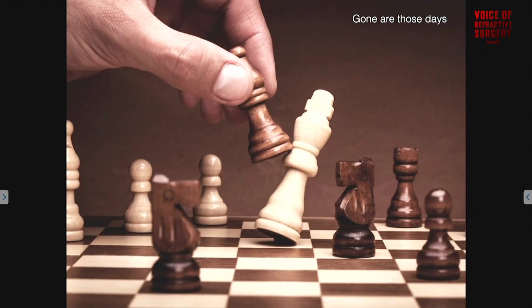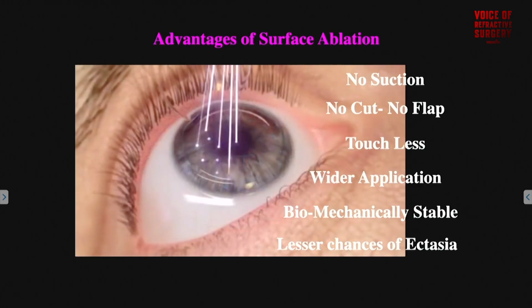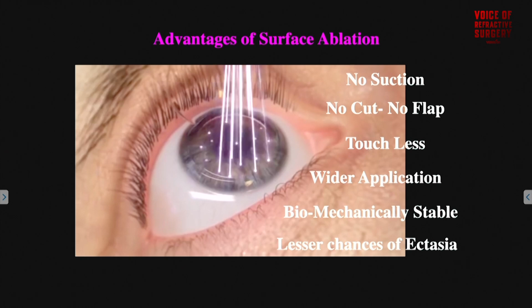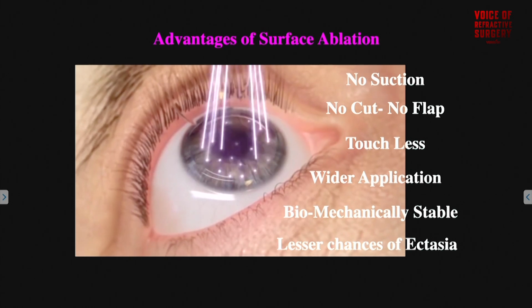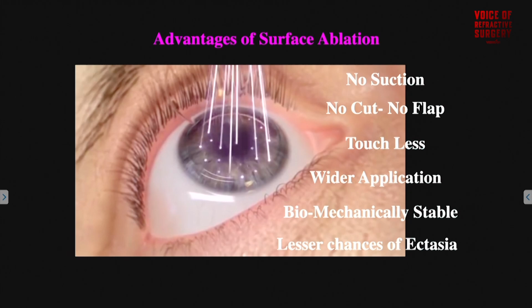But gone are those days. We have a better understanding of the technology now. And we understand that surface ablation has wider application. It gives us a more biomechanically stable cornea and definitely has lesser chances of ectasia.